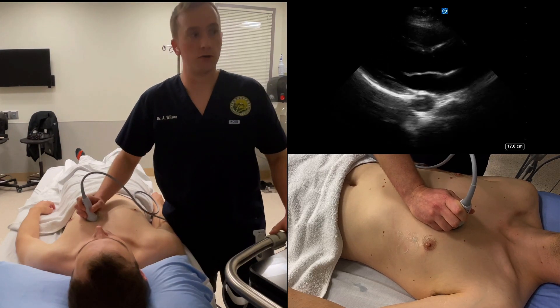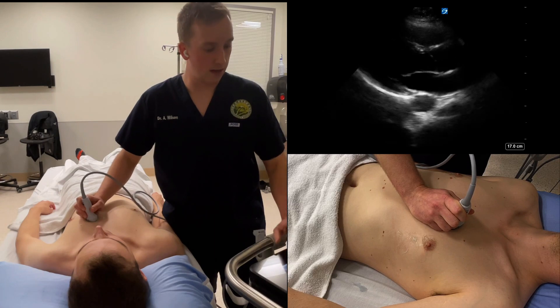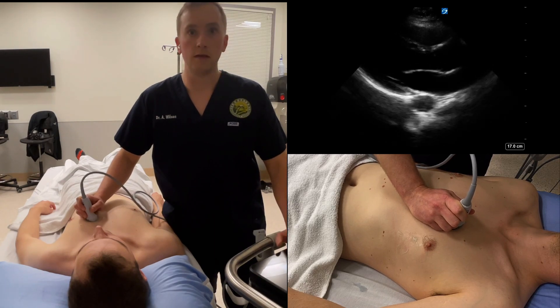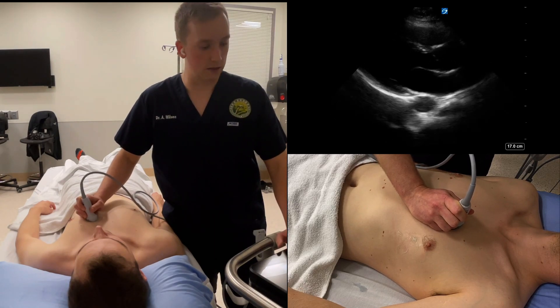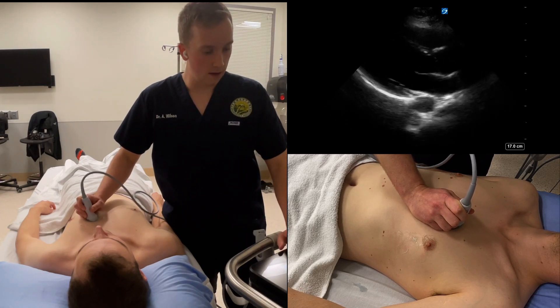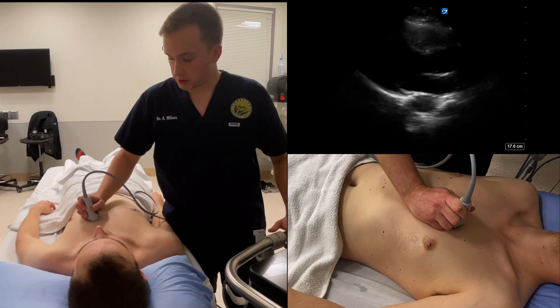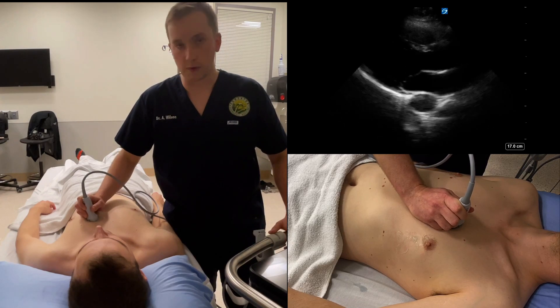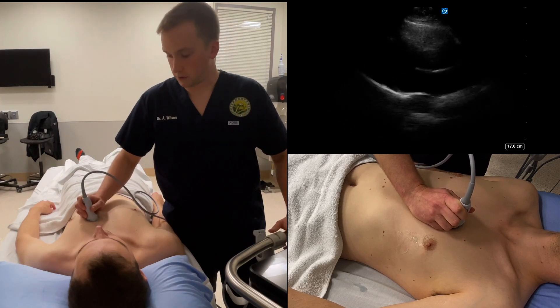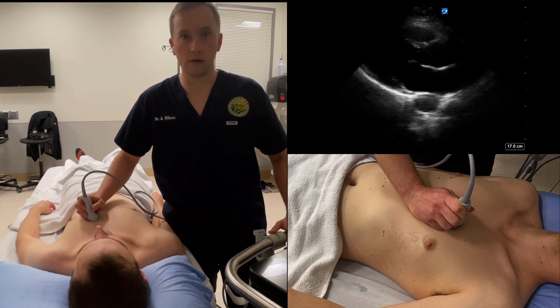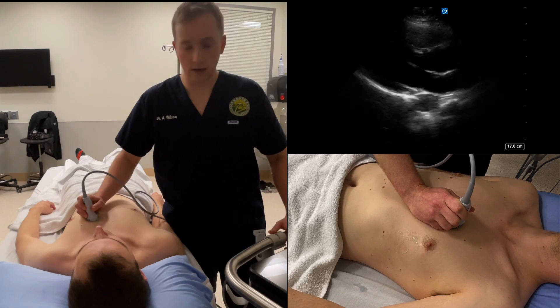After obtaining the parasternal long axis view, you want to obtain the parasternal short axis view. To do that, you're going to go in the same interspace — the third or fourth interspace — immediately parasternal on the left-hand side.